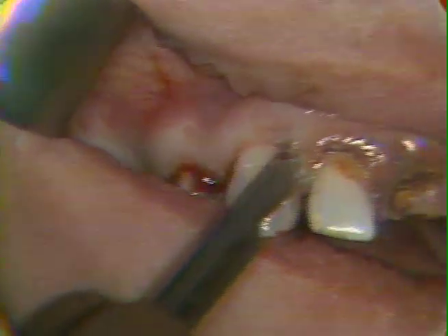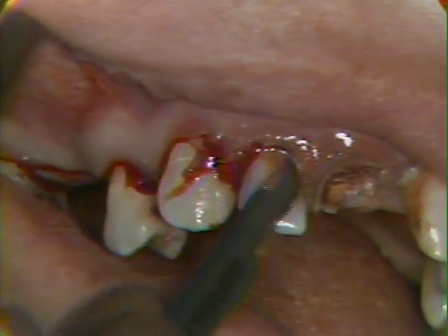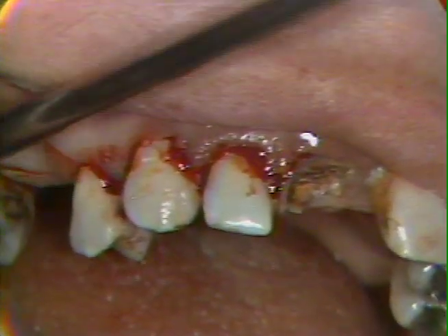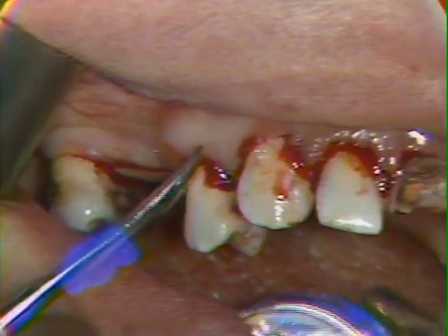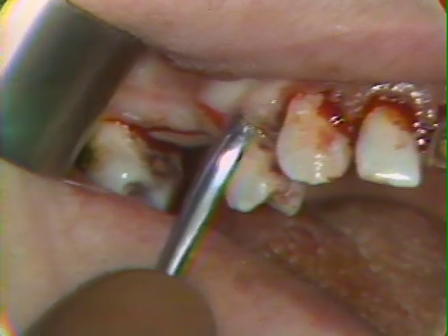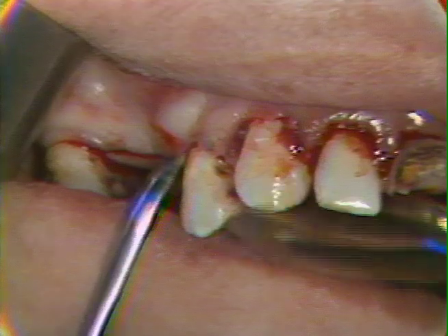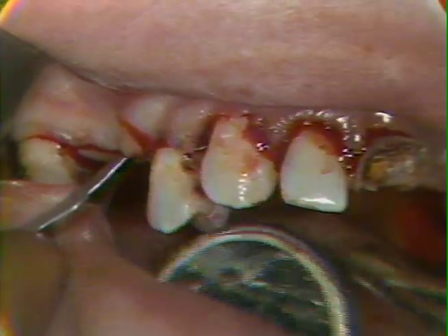We have a lot of chronic inflammatory reactivity of these tissues, and they're quite hyperemic. As we start to reflect the flaps, we use the small end of the elevator. We go into the base of the papilla until we find solid bone. Then we reflect that papilla base. Now I'll go around to the distal here and see if we can get the flap started there.